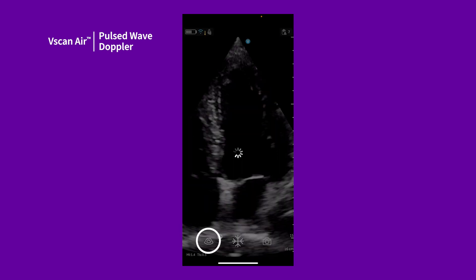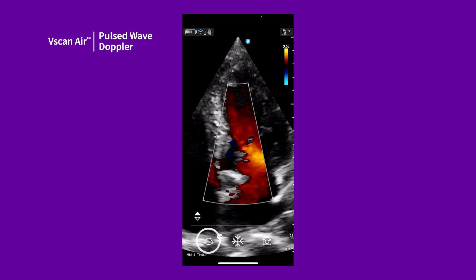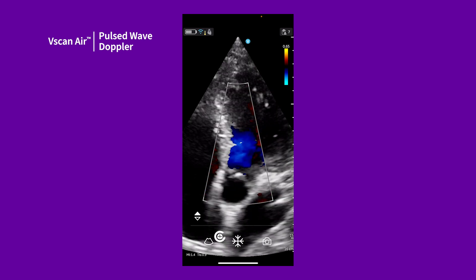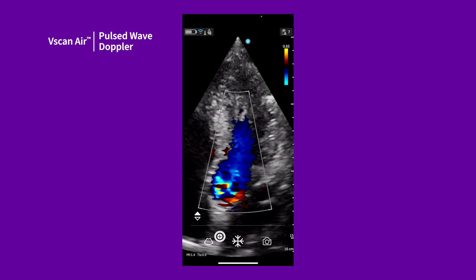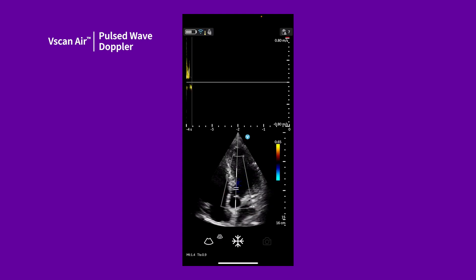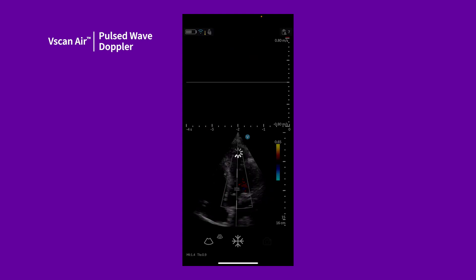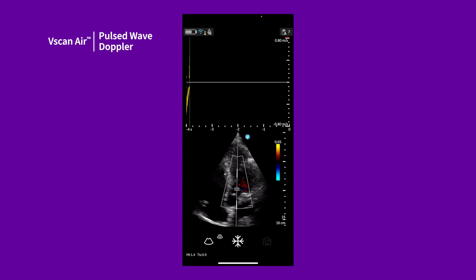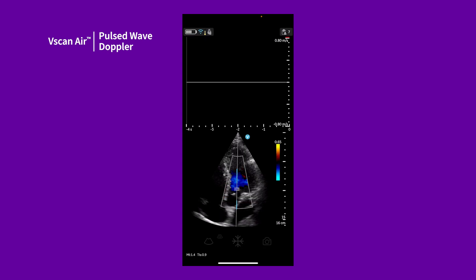Enable color to help locate the vessel you wish to examine. Tap the plus icon and select PW mode. The sample volume will automatically be placed in the center of the color box and will also follow its steering angle if you work with the cardiac probe.